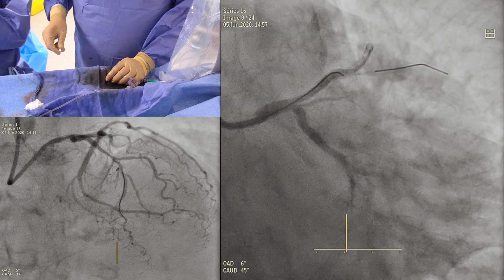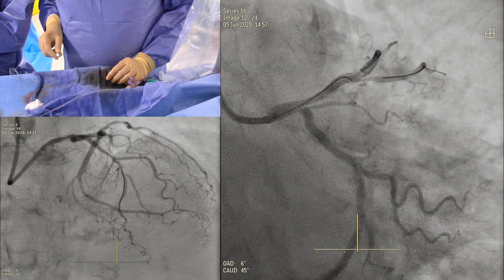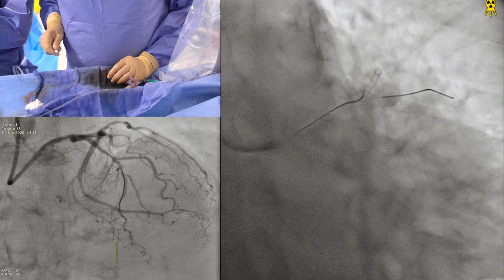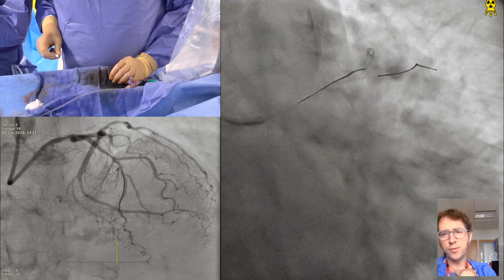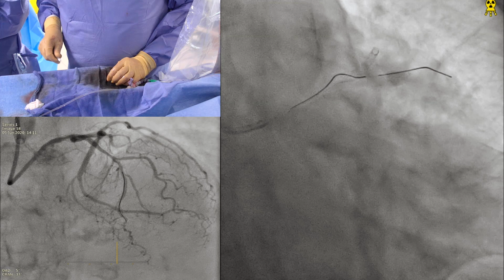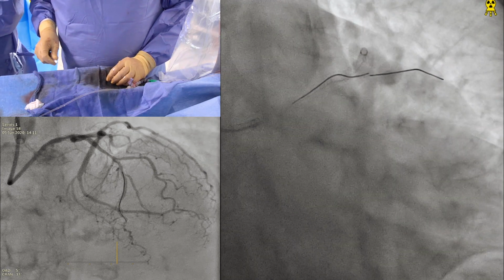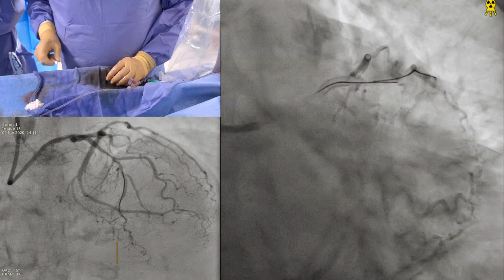Okay, so I think we have a good separation of both branches in this view. And we can see the tight stenosis that we have at the ostium of the diagonal branch. So I think this can be a good working view to access the side branch. A really nice demonstration of how we were fooled in the view we felt was so helpful. Absolutely. So you just see it interacting. Okay. This one is okay. Thank you, Bernard. Very nice. Well done. Okay. Perfect.